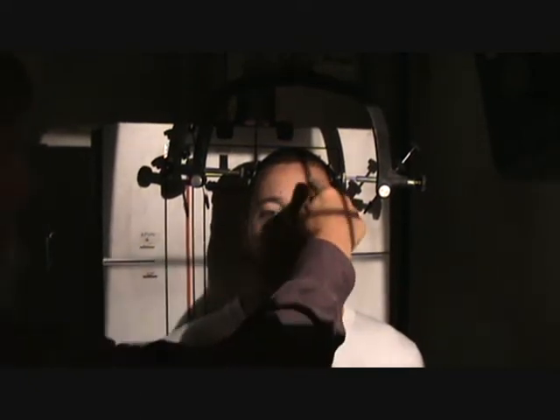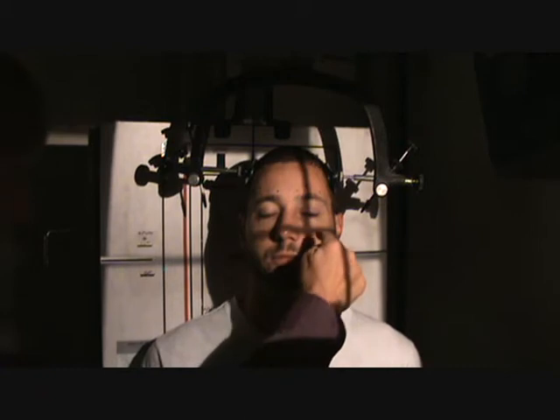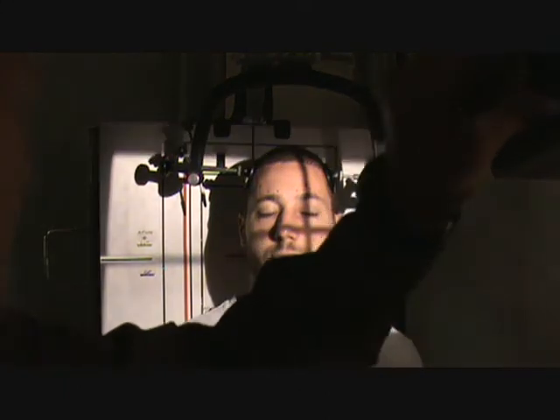The vertical collimator crosshair goes through the indicated dot. The horizontal crosshair is going through the indicated dot above the patient's brow, through the middle of the maxillary sinus, through the TP on the opposite side, and hitting the bucky in the center. The normal head carriage dots are lined up and the ear pointers are pointing to the tragus on both sides — we have this patient lined up. We'll go ahead and collimate.